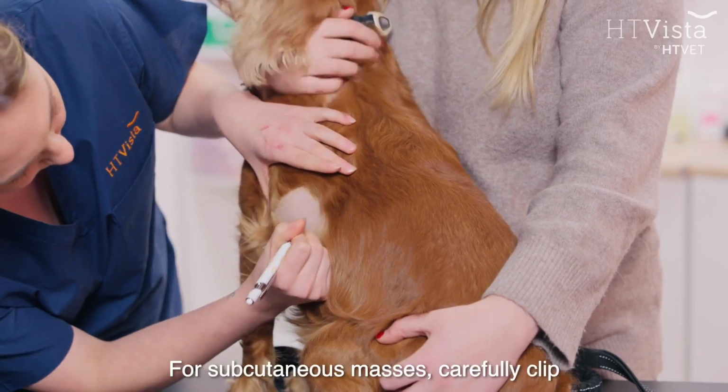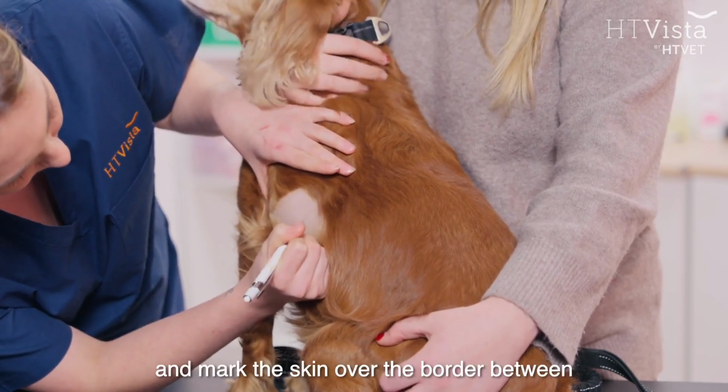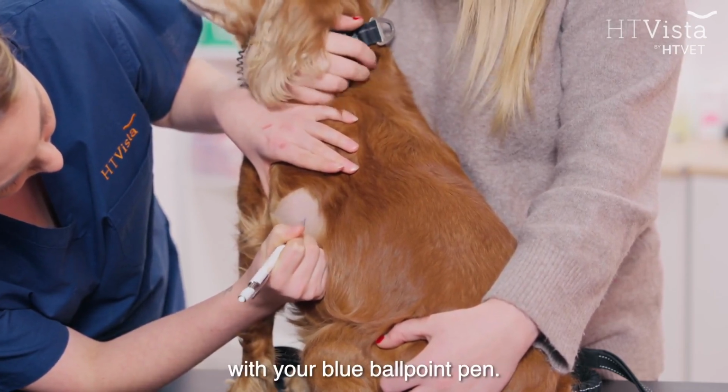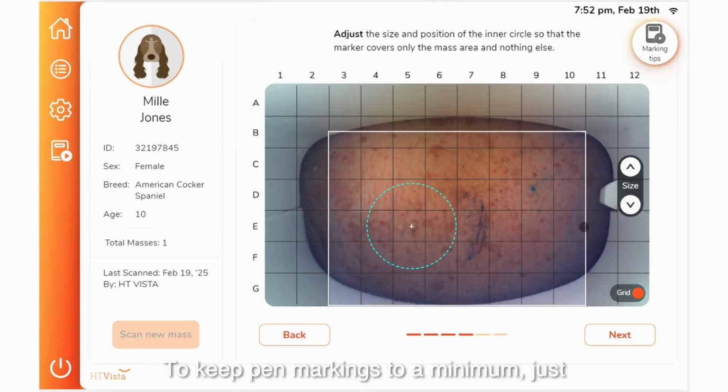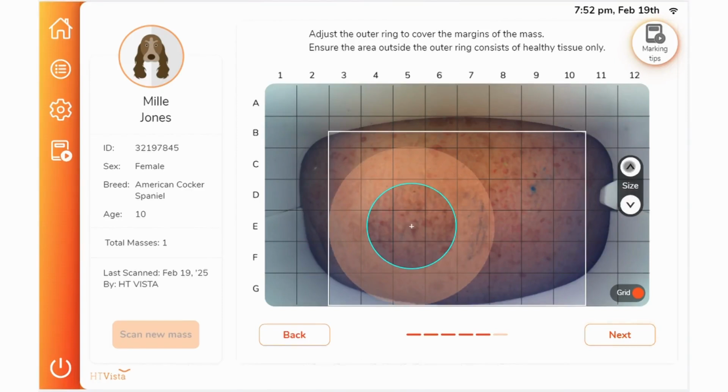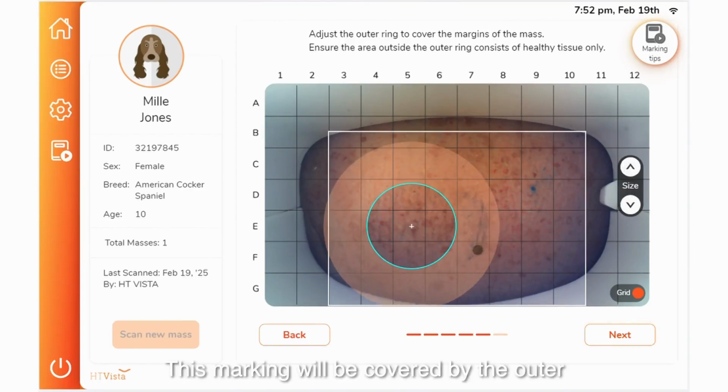For subcutaneous masses, carefully clip and mark the skin over the border between the mass and the healthy area with your blue ballpoint pen. To keep pen markings to a minimum, just identify the border between the mass and the healthy area. This marking will be covered by the outer ring and won't be included in the AI analysis.